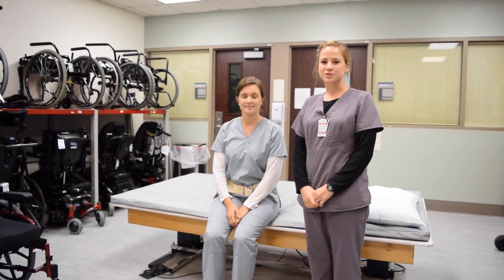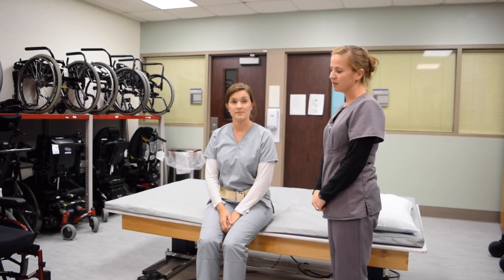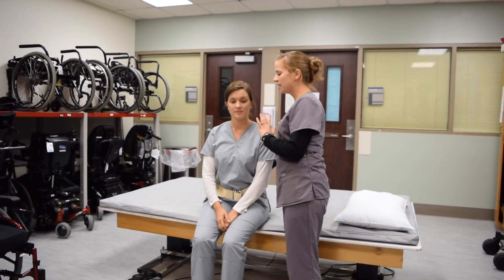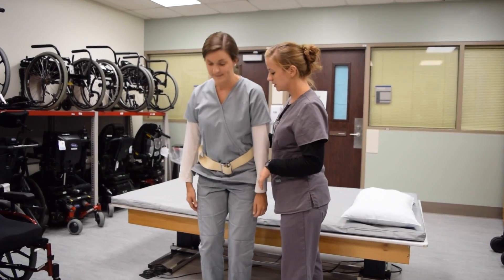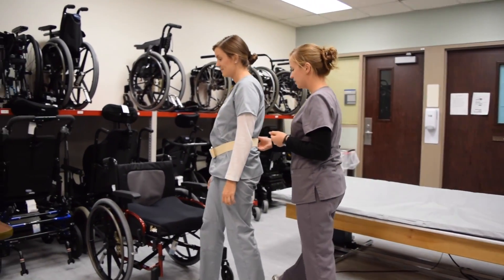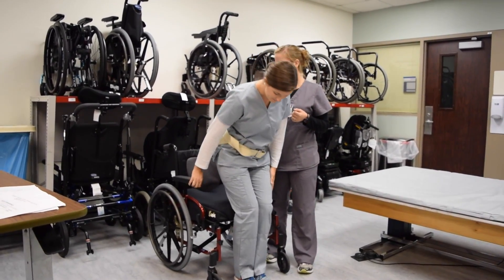The following will demonstrate an ambulatory transfer. Your patient will be sitting on the edge of the bed, and you'll have one hand on the back of the gait belt and one hand free to guard their upper body in case of loss of balance. Have your patient lean forward to stand up and then ambulate to their chair. The patient can then turn around and reach back for their chair before sitting.